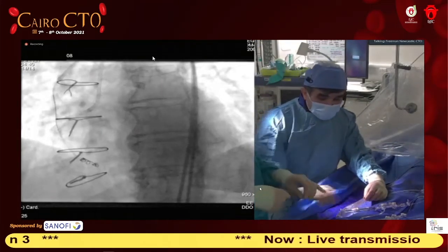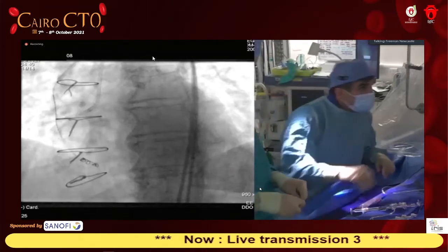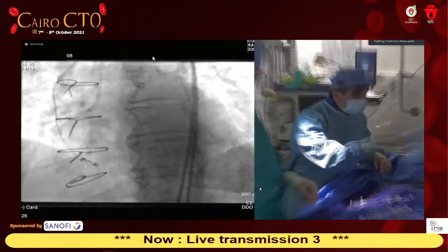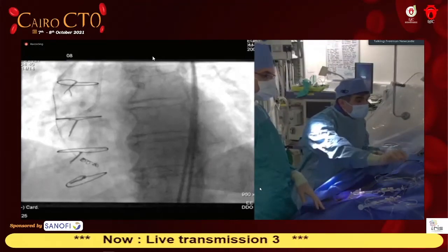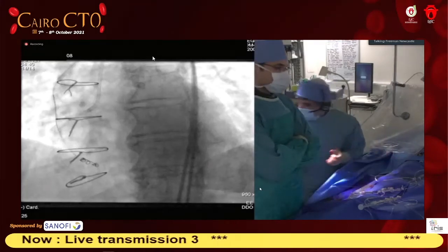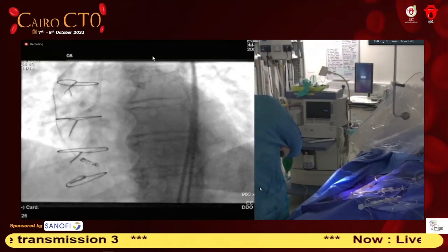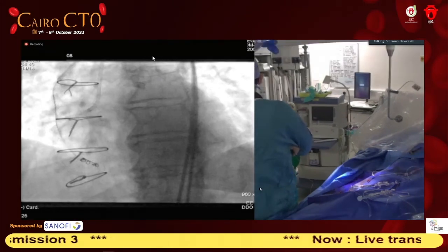It's a bit smaller than expected. So I'm going to have a look and see if you have a hairy coil. What I could do now, I could advance my microcatheter or the Prograde beyond the first one to just jam them together, and want to deliver the third one in between. Yeah. There should be some hairy coils here. Let me see. What do we have?